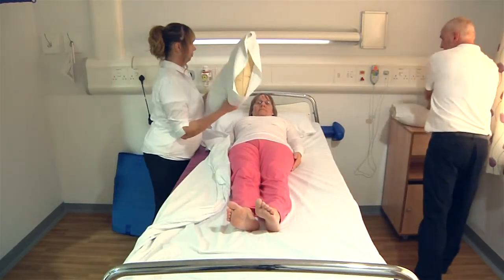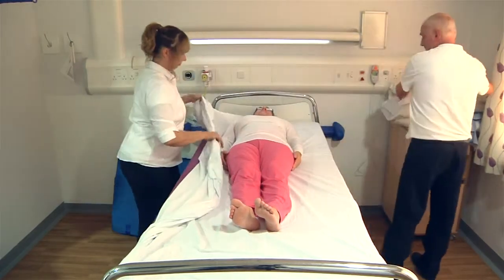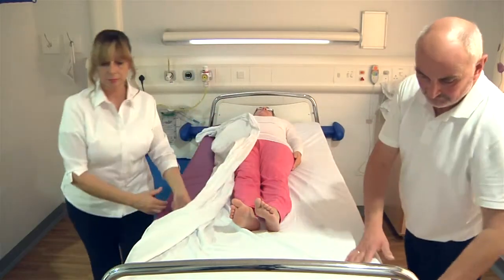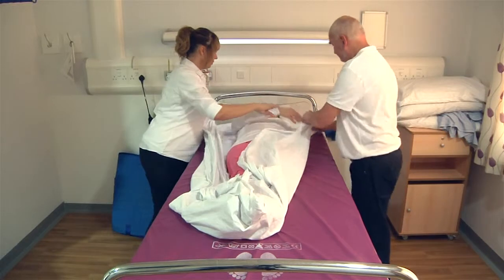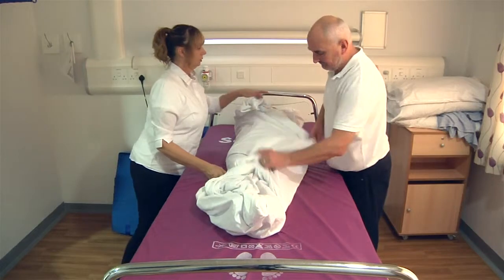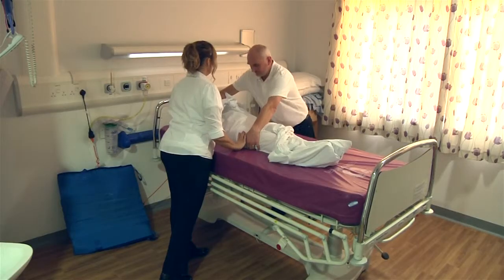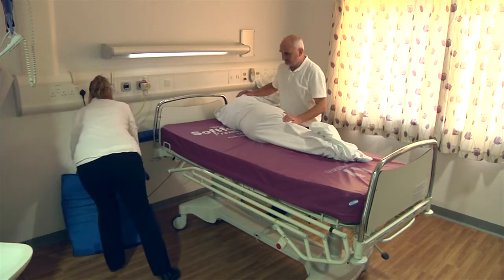Remove the patient's pillows and put them to one side ready for use later. To prepare the patient for evacuation, wrap her in her bedding — this will ensure they are kept warm and adds extra protection. Roll her onto her side, ensuring that they are well supported.